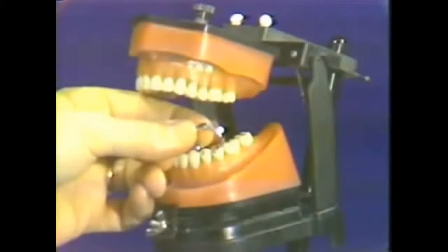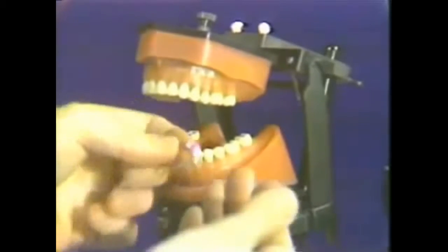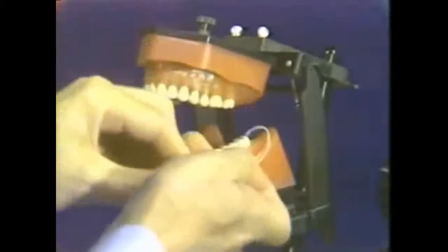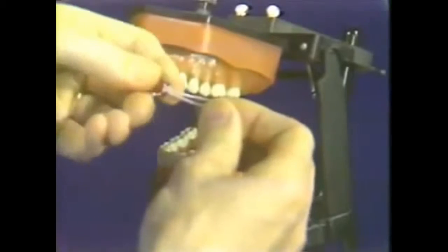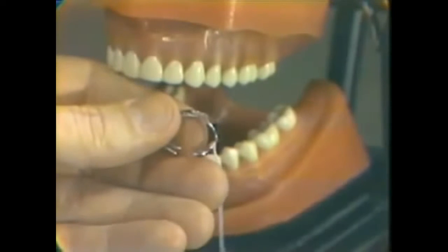In order that it be secure and safe to use, we always place a floss ligature on the clamp, developing it in this fashion, taking the floss material in a loop, and merely placing the fingers through it and carrying this into a closed loop, which can be placed over the clamp and onto the bow of the clamp and drawn down securely. This provides a handle in case the clamp should be lost during any part of the operation.